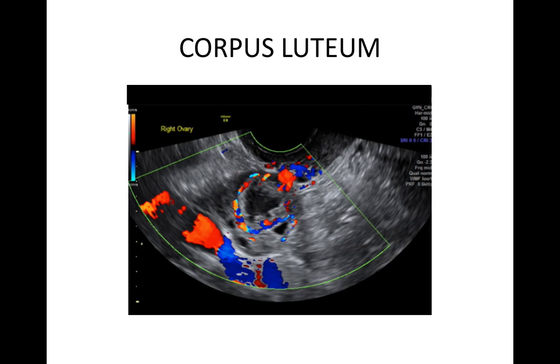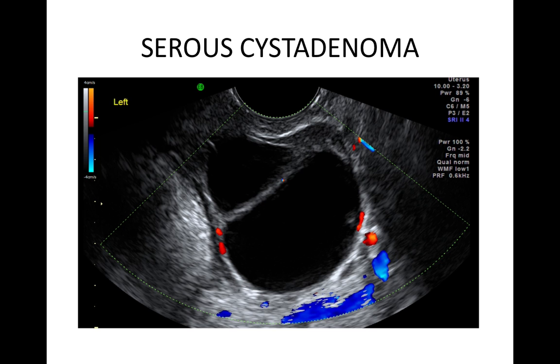A corpus luteum shows the typical peripheral ring of fire with color Doppler. A serous cystadenoma is a thin-walled cyst that contains serous fluid. It can be unilocular or multilocular — this example is multilocular — usually with fewer than 10 locules that have no solid material and contain anechoic fluid. The cyst wall is regular, there is not usually any shadowing, and the vascularity is minor.